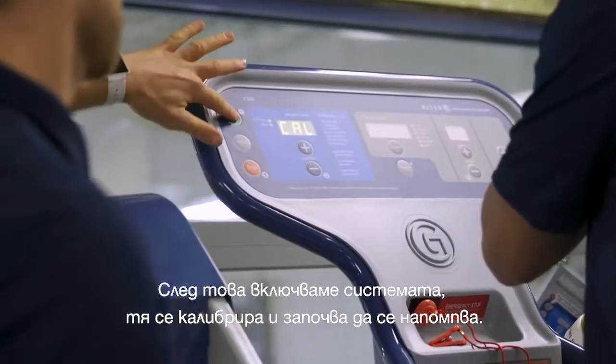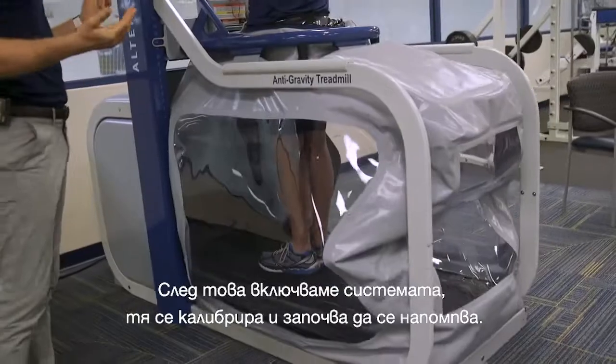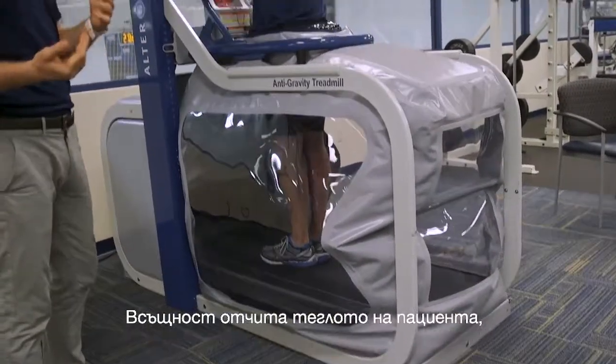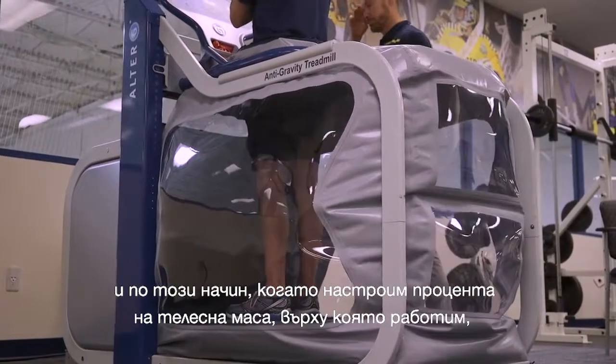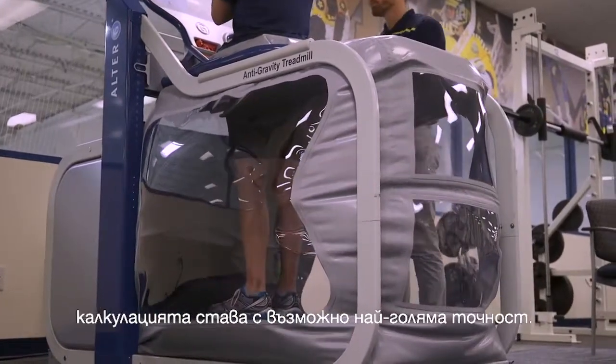Then we're going to turn the unit on. The unit has to calibrate and start to inflate, basically taking the patient's body weight, so that when we adjust the percent body weight we're working at, it's doing it as accurately as possible.